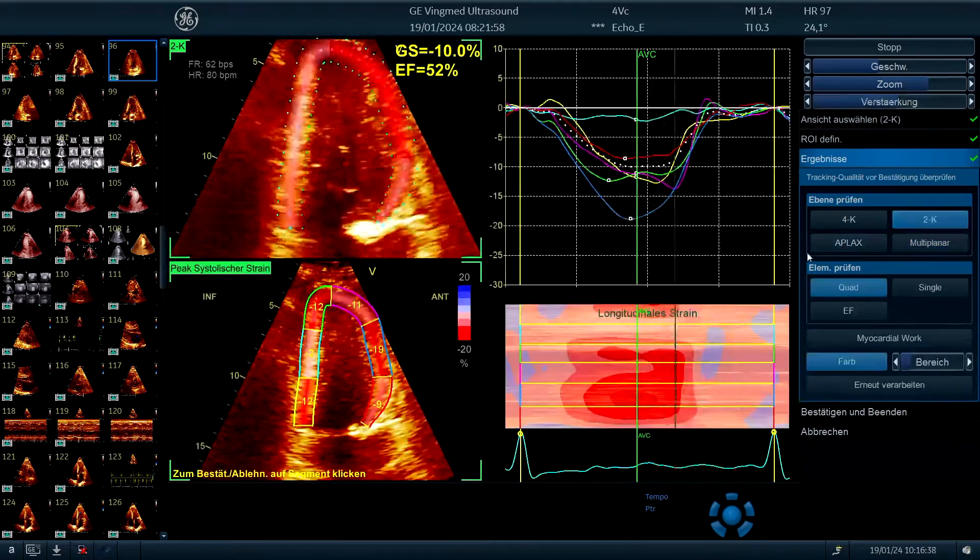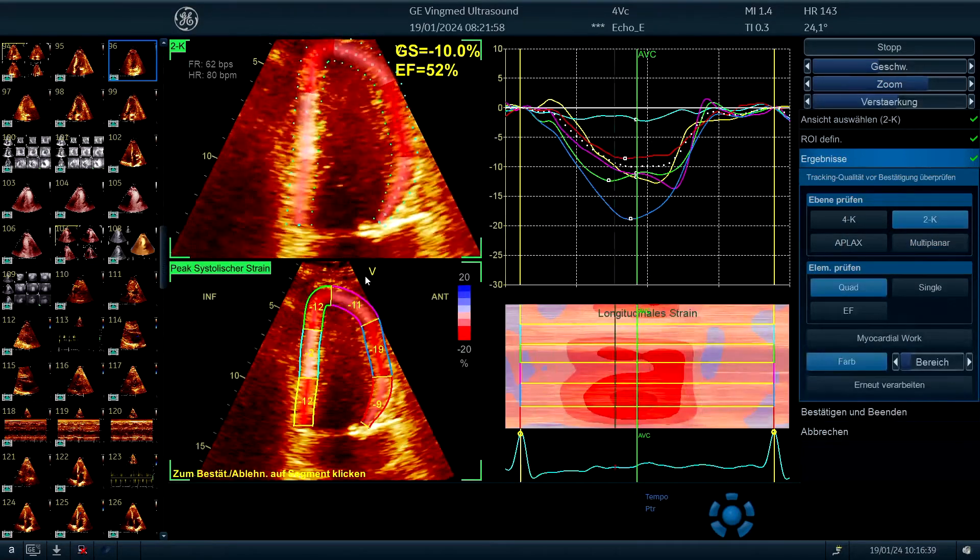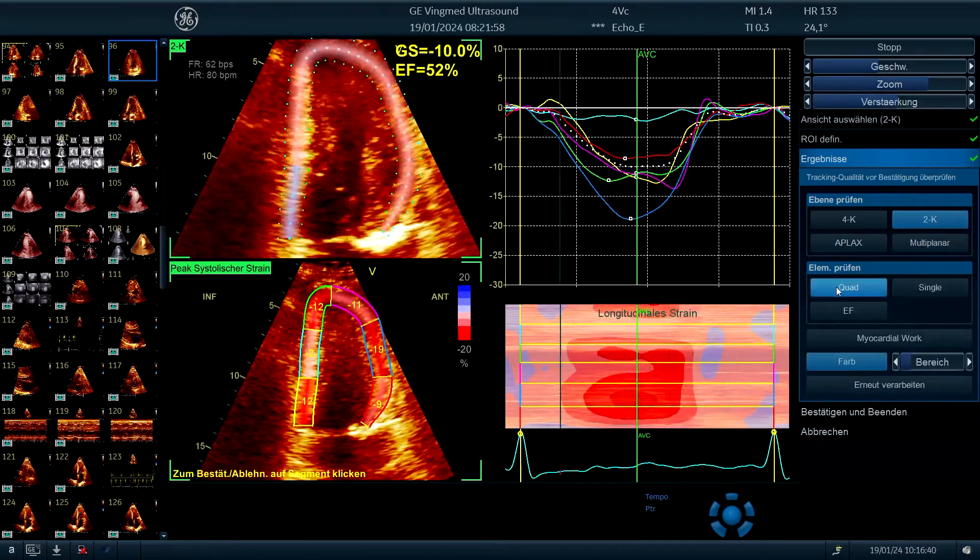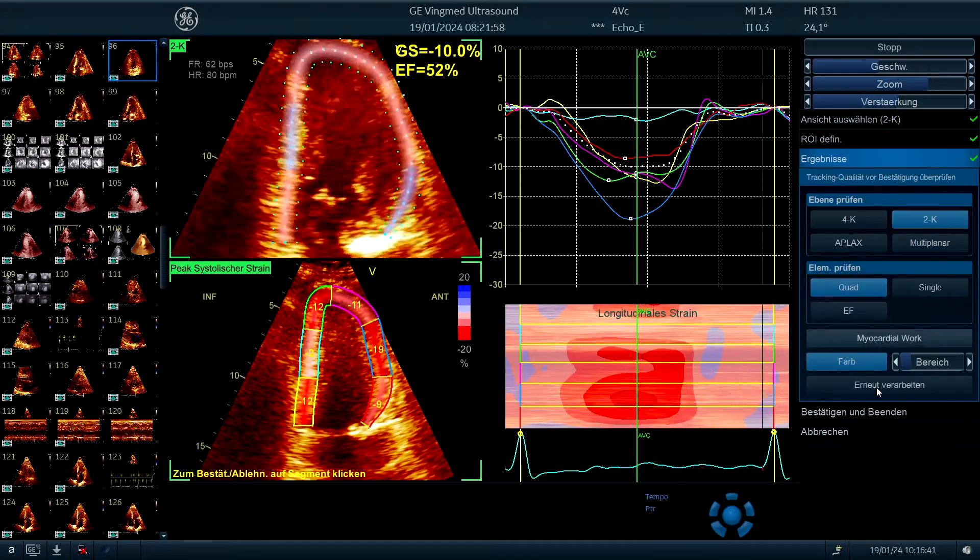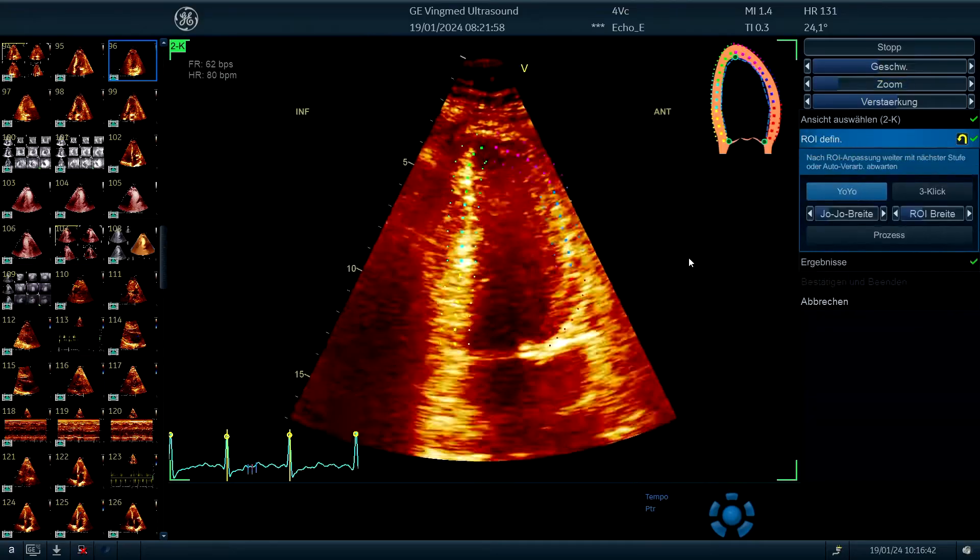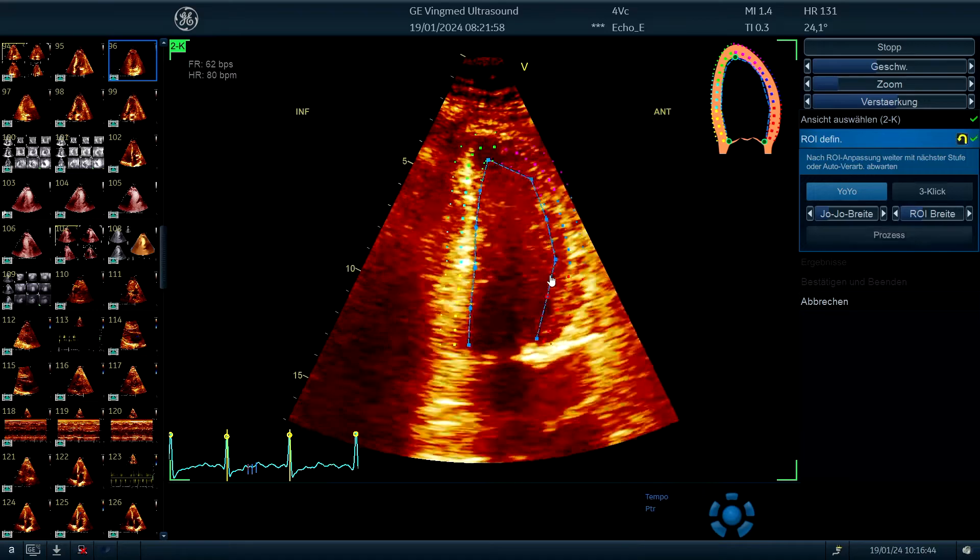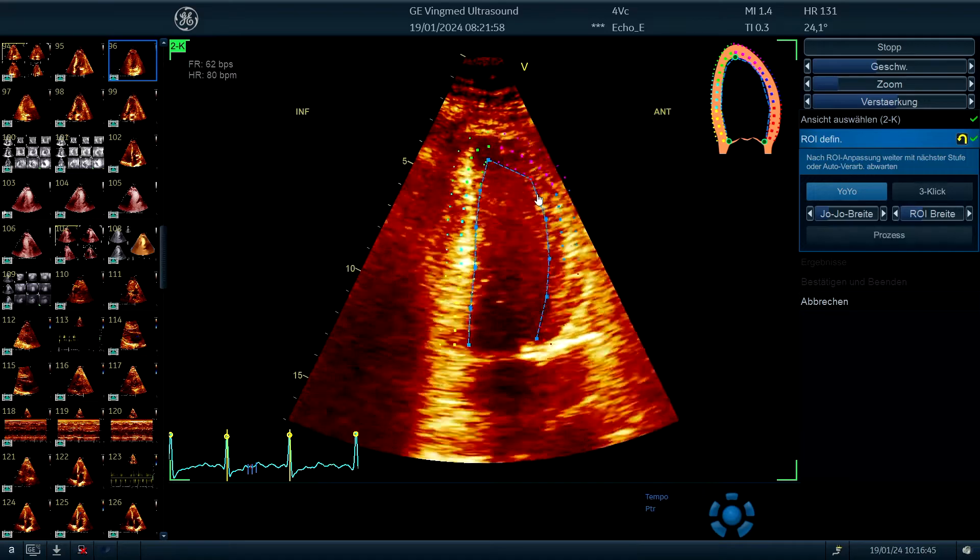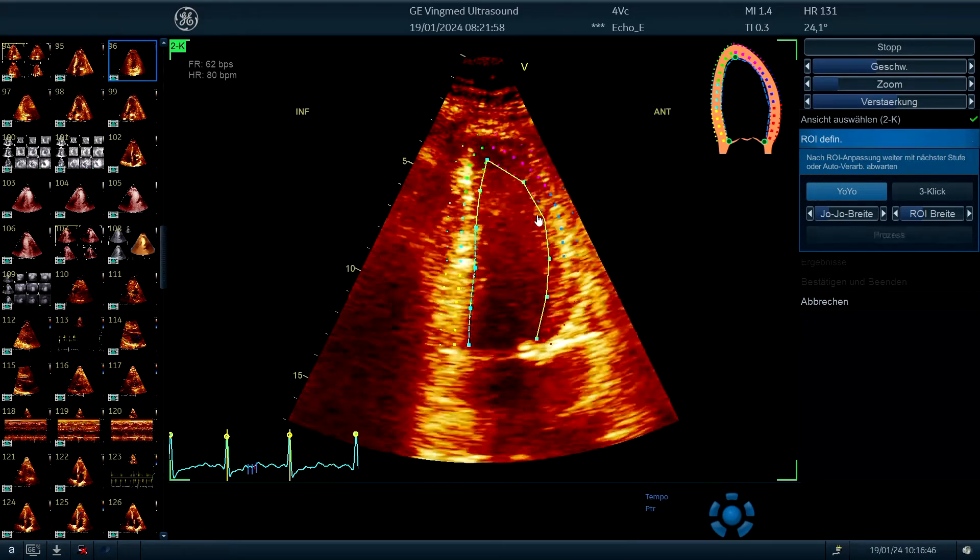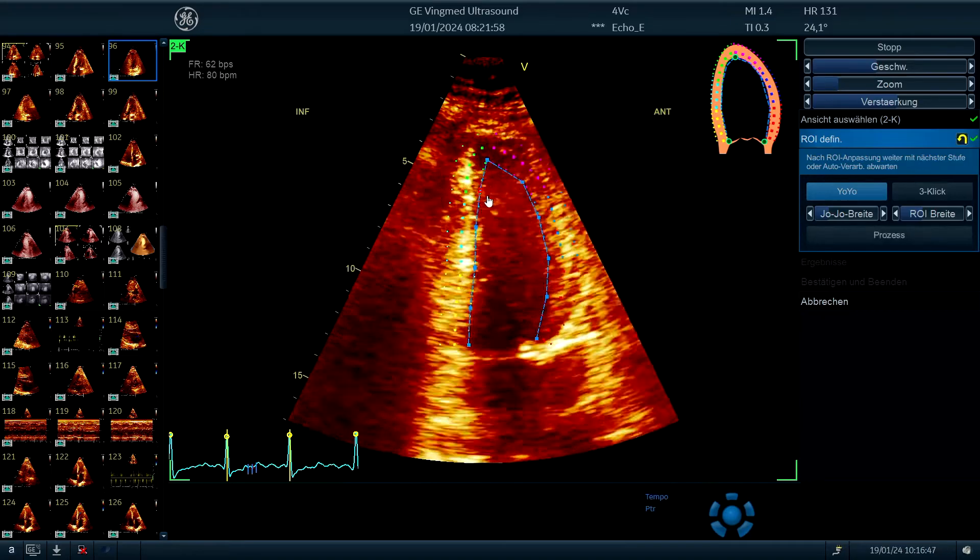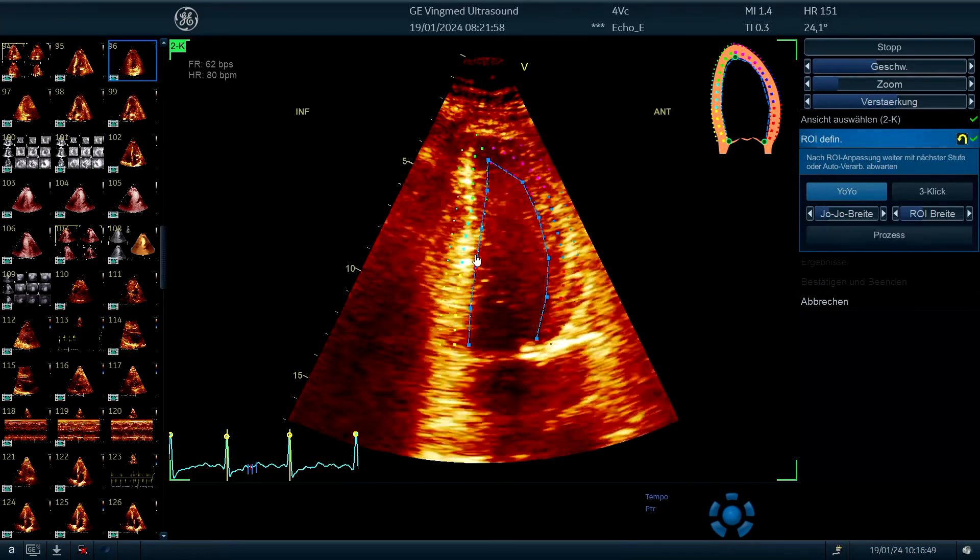Now, again, I want to see the two chamber view. So here it is a bit underestimated. So we probably have to adapt it a little bit, but this is just now, I would say, cosmetics.